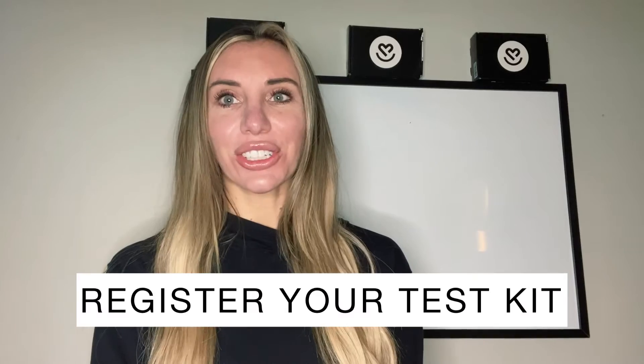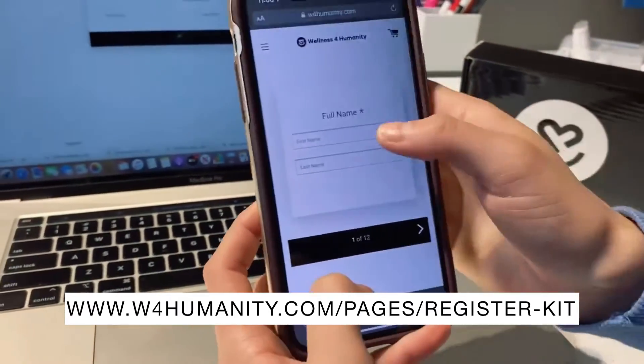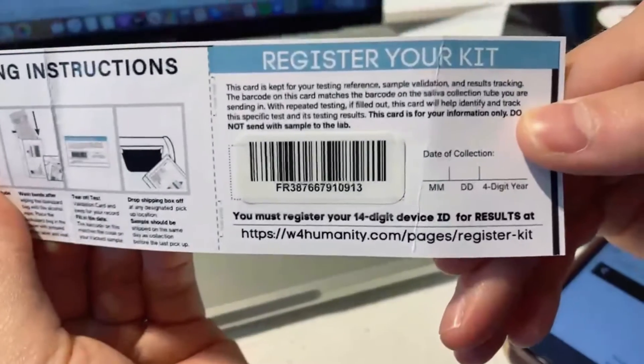Now that your Wellness for Humanity Home Kit has arrived, I'm going to offer three simple steps to help make sure that you get your results on time. First, make sure you register your test kit using your name and an email address. You will find this information on the insert inside of the box.